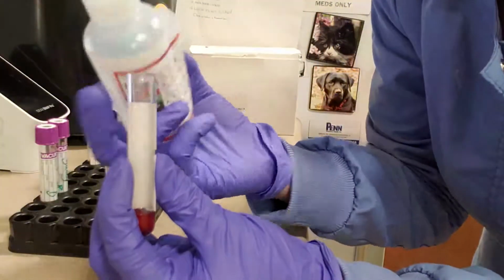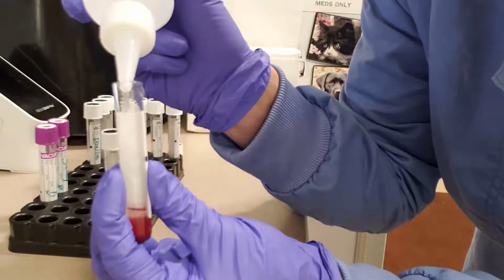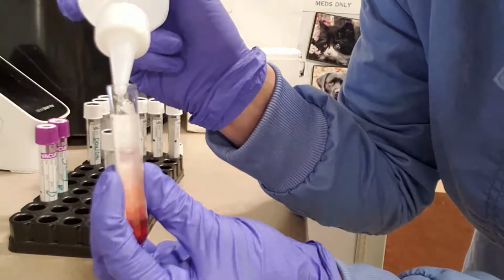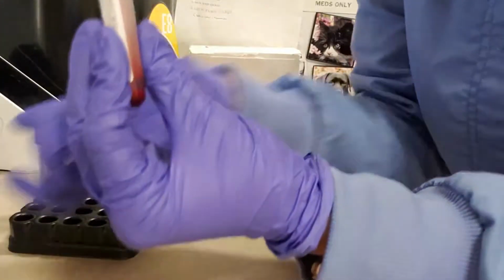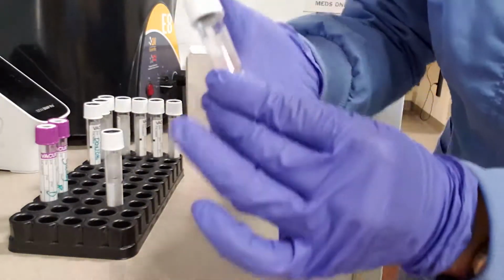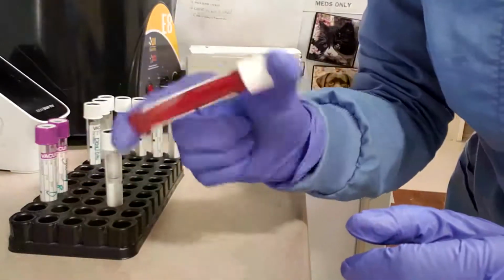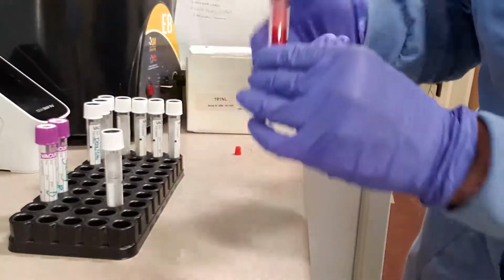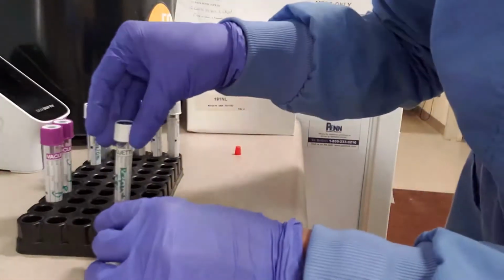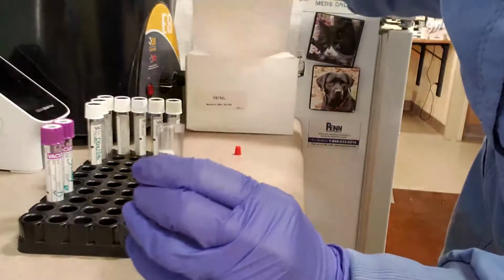And for our last time, we want to add our saline. Make sure it's about 3/4 of the way. And then we want to invert it so that it's washed. Put it back into our centrifuge. And then with our recipient, do the same thing.